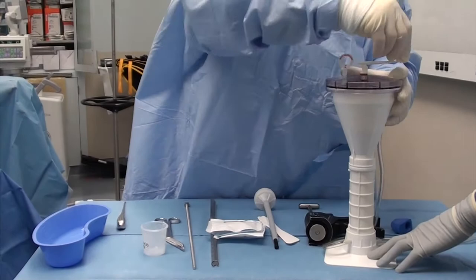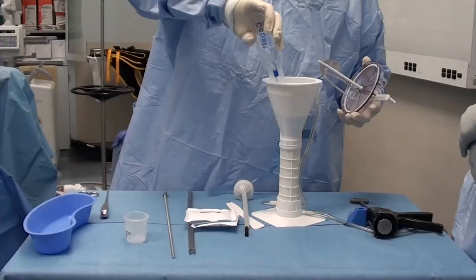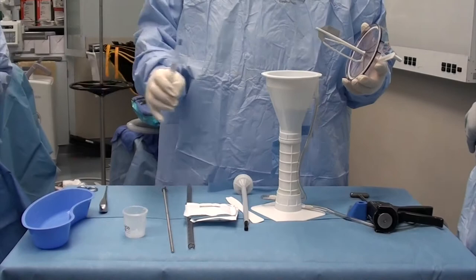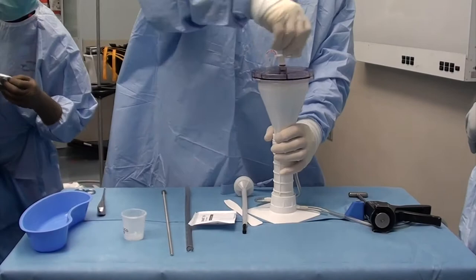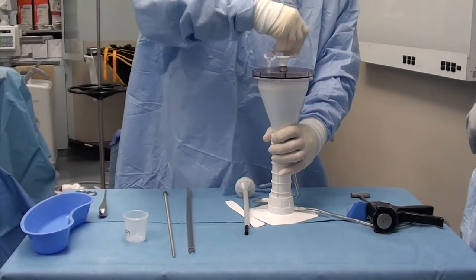Next we're going to go ahead and mix up our cement and add our polymer. Then pressurize — we're just pressurizing so we can get the cement into the gun. Any cement gun works here. I like to wait until the cement gets a little bit doughy.